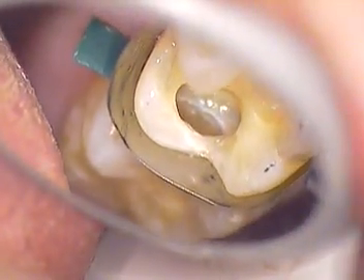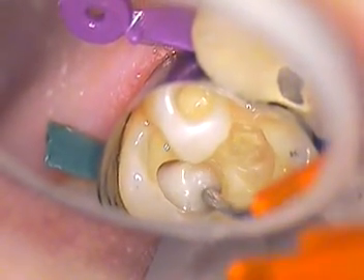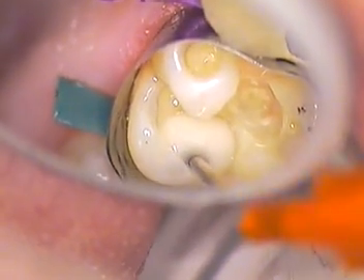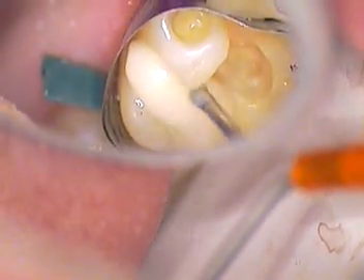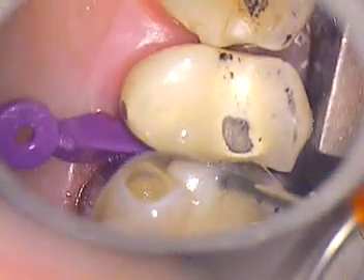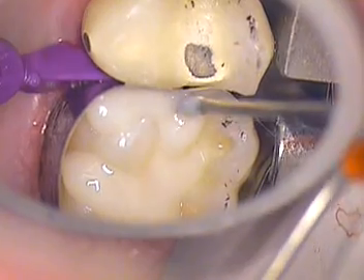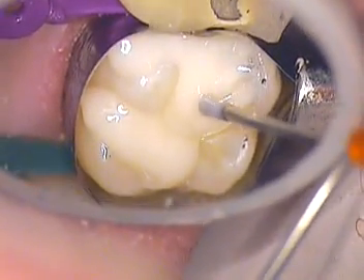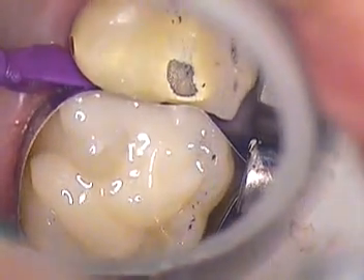There's our tunnel prep. We'll squeeze a little bit out first and then go all the way down into this zone, slowly injecting and moving the tip around, preventing any air entrapment — slowly moving the tip. And that, ladies and gentlemen, is how you put one mix of core paste into a really difficult area. Very nicely done, Maria.